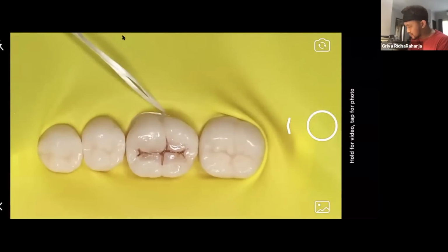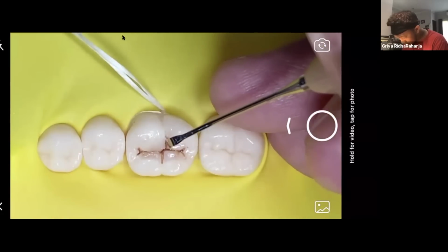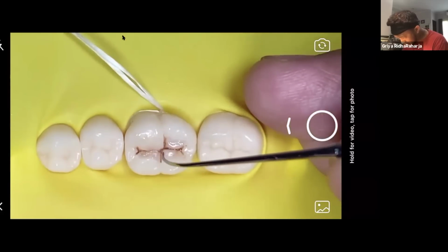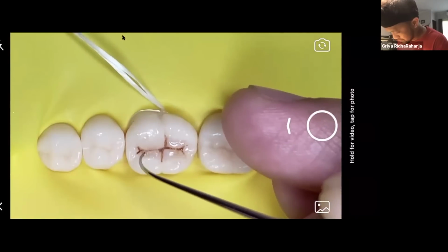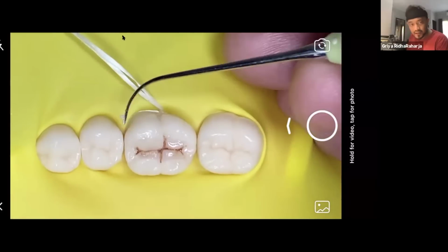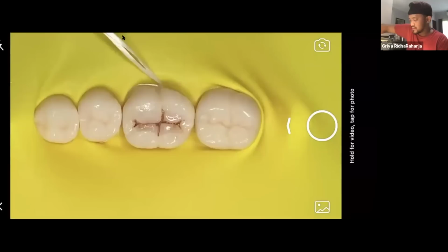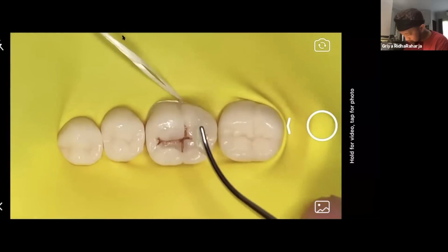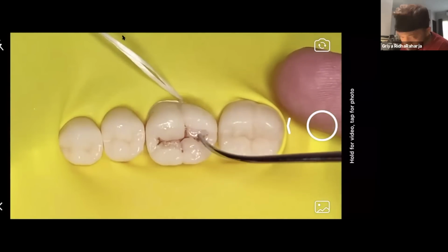So the point is, I love brushing to make sure your composite is very smooth, and it's easy to polish after that. One cusp is done, and then like here. After this, I love to go a little bit diagonal. I will place my composite in the lingual in here, like this. Okay, push again, pushing. See?